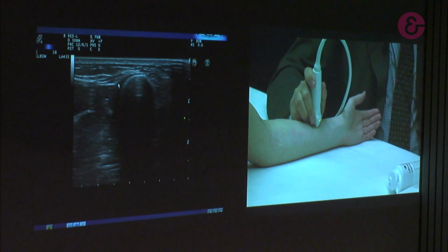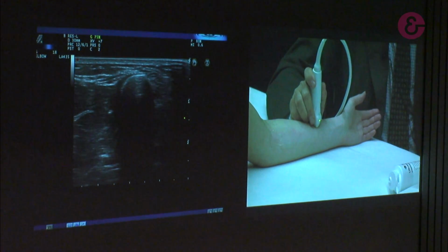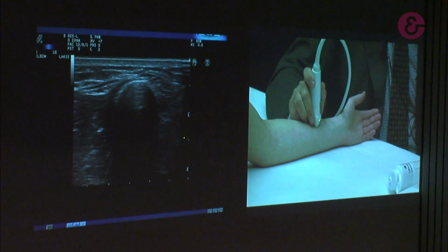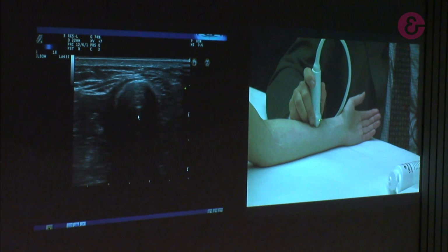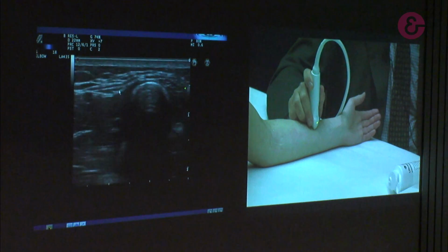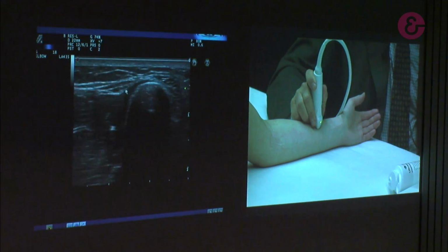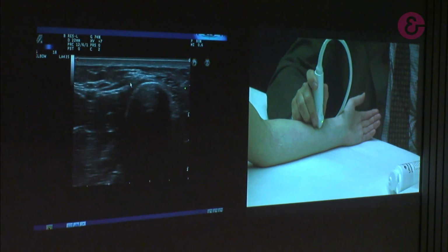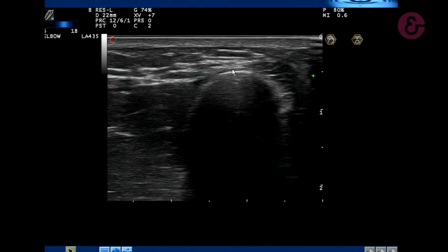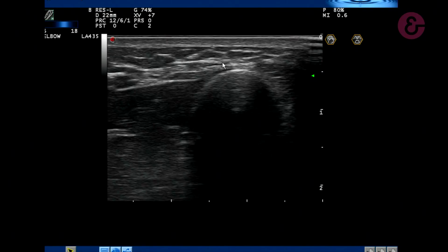I have just to zoom the image, and to rise the most possible. Okay. And this is my arrow. So once again, look at the nerve. This is the nerve, the tendon, the nerve, going in between the two. And this is the nerve, which goes superficially.